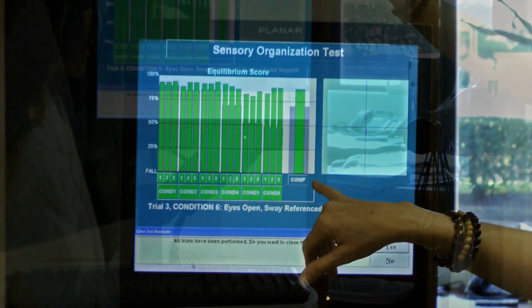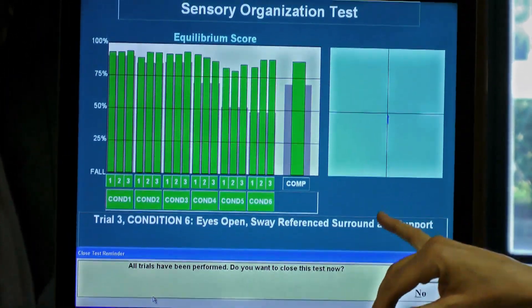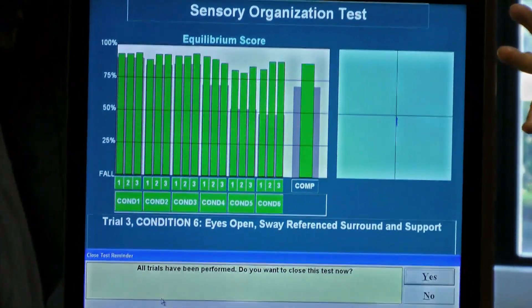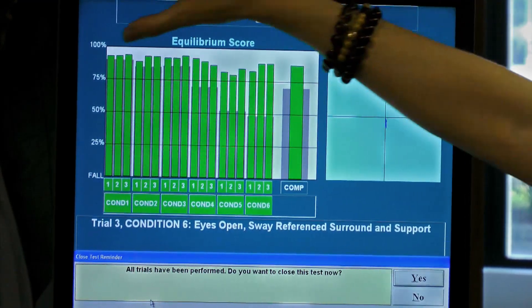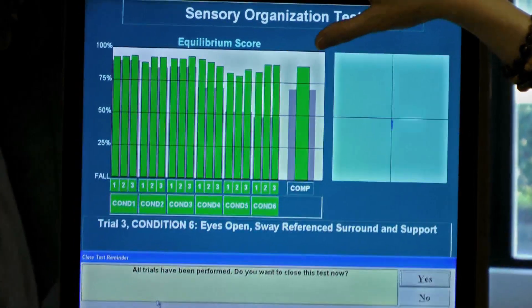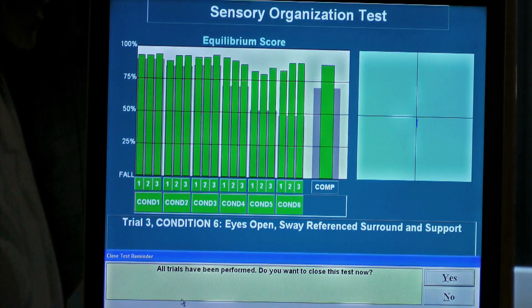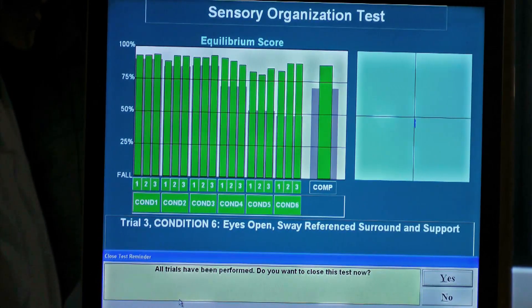We have a composite score which is an average score of all six trials, all three conditions of each trial. She's well within the normative range — her stability bar is green and it's very close to 100% stability as far as her equilibrium score. This is a very, very good test result. This score is based on normative data for people of her same height and age, so she's falling into the normative category for her height and age.